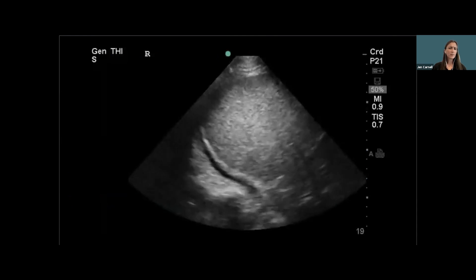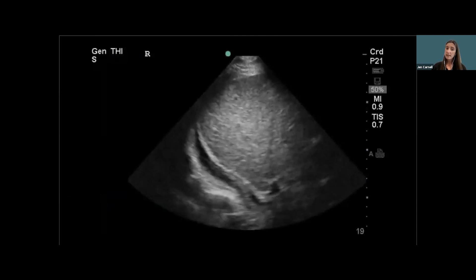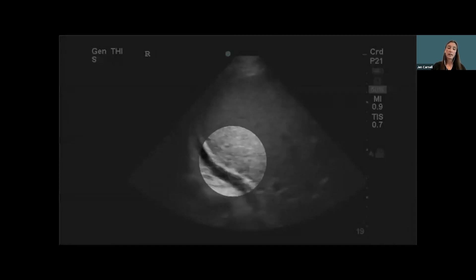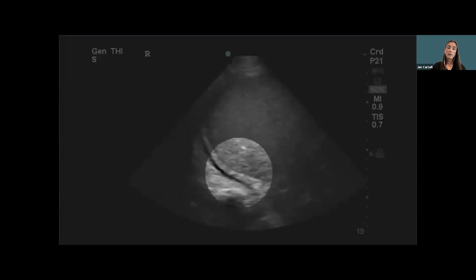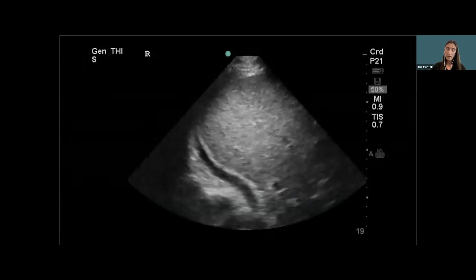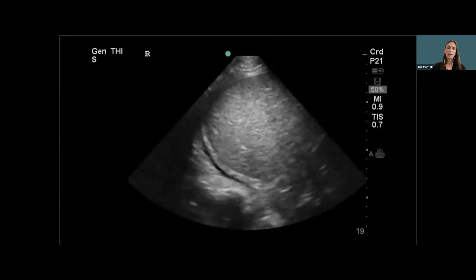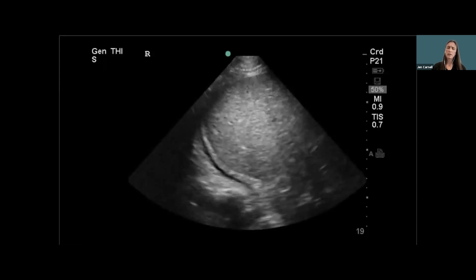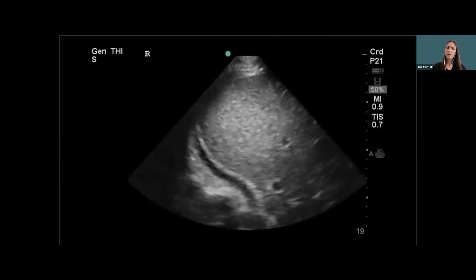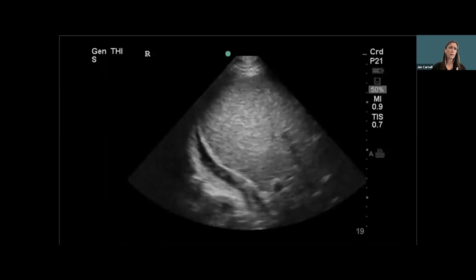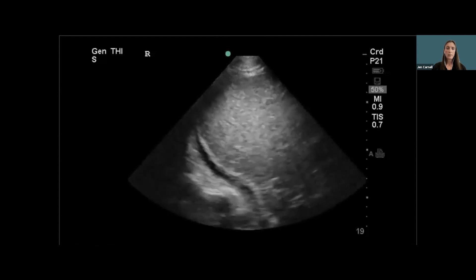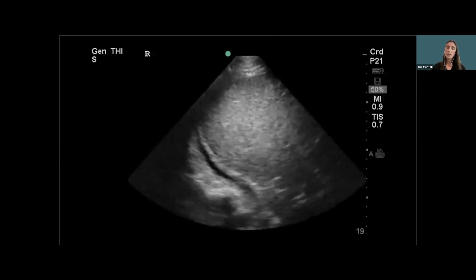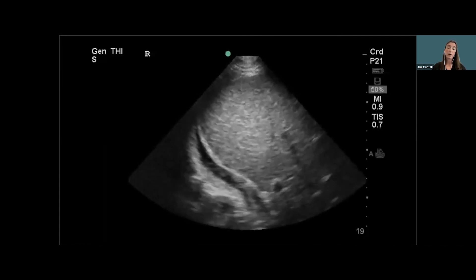His gallbladder is once again pristine. But I like to look at adjacent structures, so I scan a little superiorly and get a nice view of the diaphragm — bright white — with a sliver of fluid above it. This is basically a small pleural effusion, and it piques my interest. The pathology is not in the belly for this gentleman; it's in the chest. This makes me specifically worry about a pulmonary infarct in the setting of PE.